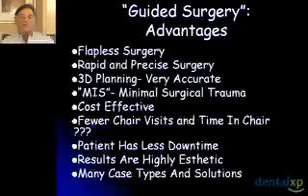So just to summarize, with guided surgery, we have many advantages. Surgical colleagues would appreciate the precision and rapidity of a flapless technique. It's more comfortable for a patient, and using a surgical template, the implants are going in exactly where we place them. We see from postoperative results on the x-rays, and there are some studies performed on cadavers, that the transfer of the information is very, very precise, in the magnitude of hundredths of millimeters in precision.